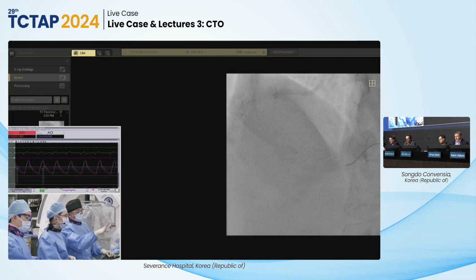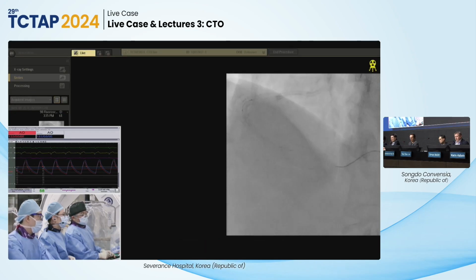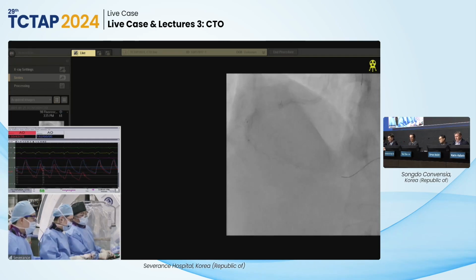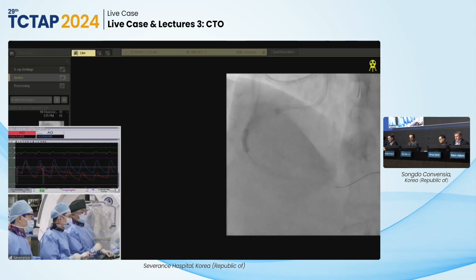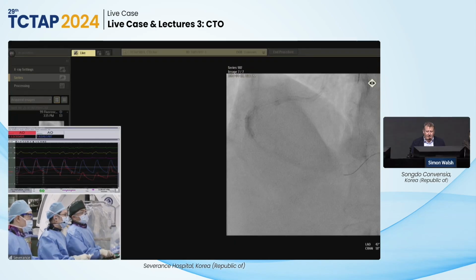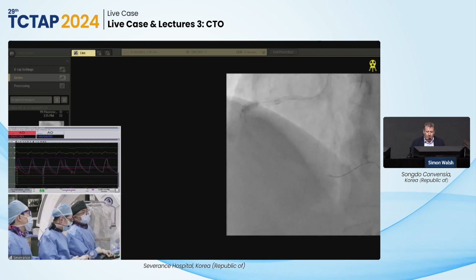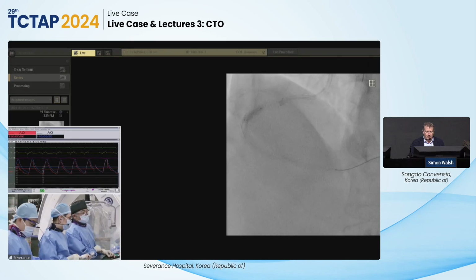So after checking the full pressure of the post dilation, the pressure now is about 18, and 20. 18, 20. 22. Yeah, I think a good rule of thumb here is that more pressure at the same size is better than bigger and bigger. That's when you get into trouble with the risk of perforation. 20, 24.